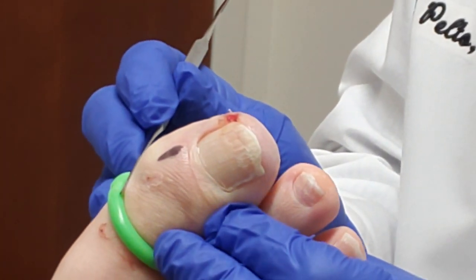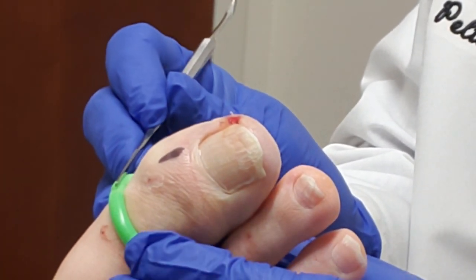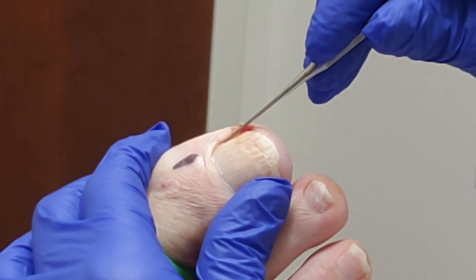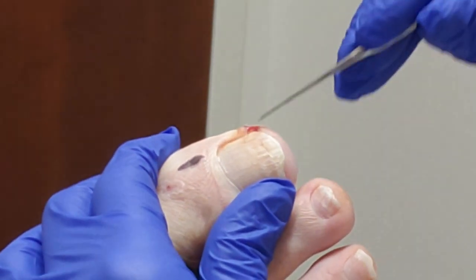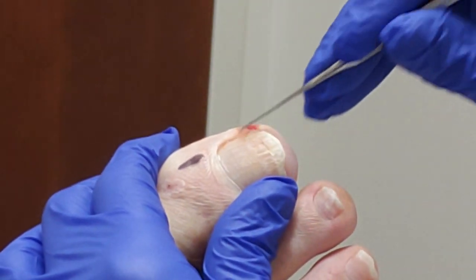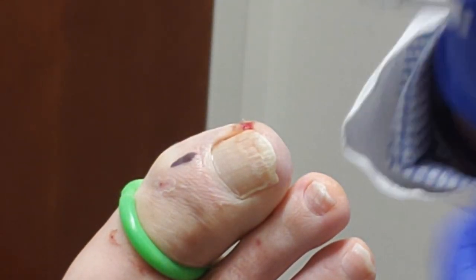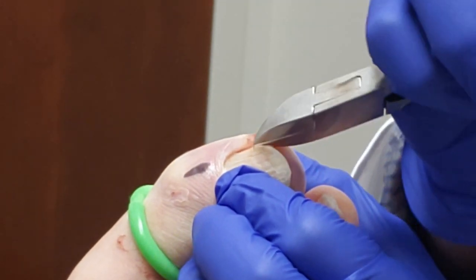His toe is already previously numb — that's a question I always get. And this little green thing everyone always asks me about — this is just to stop the blood flow temporarily so we can do the procedure. So what I do is I free up the skin from the side. If you have any discomfort, please let me know. Free up the skin underneath.